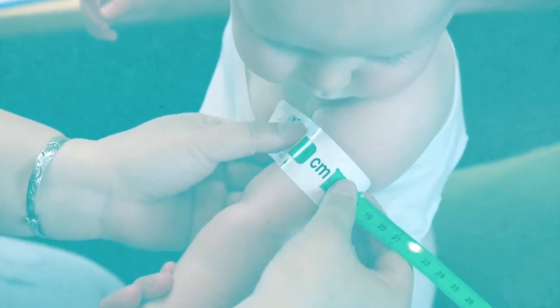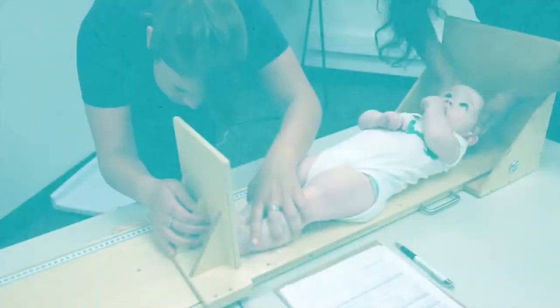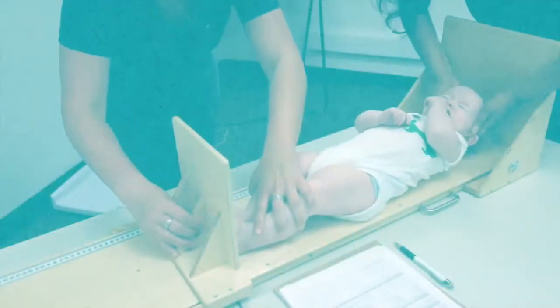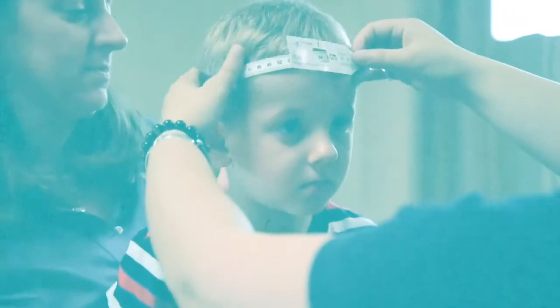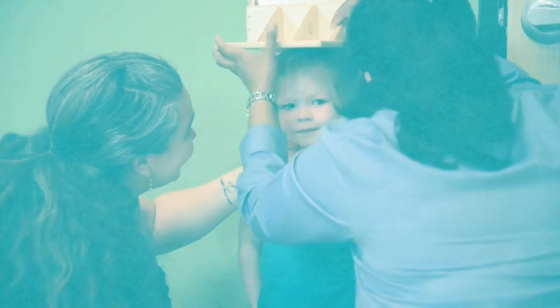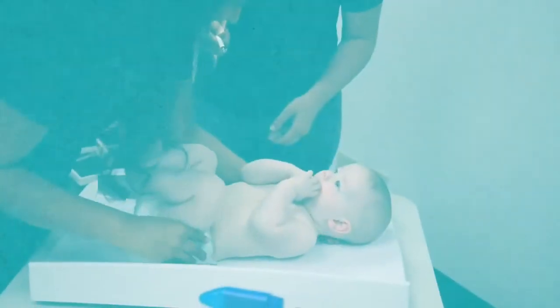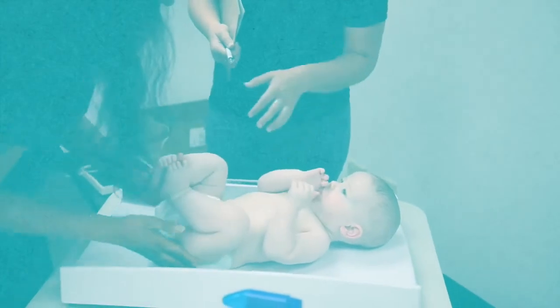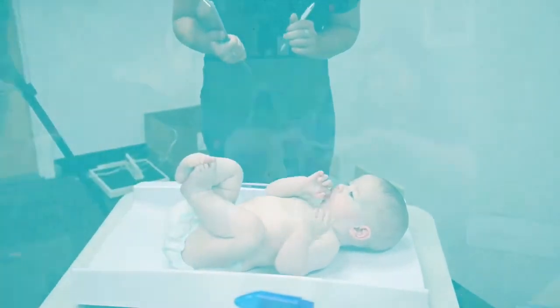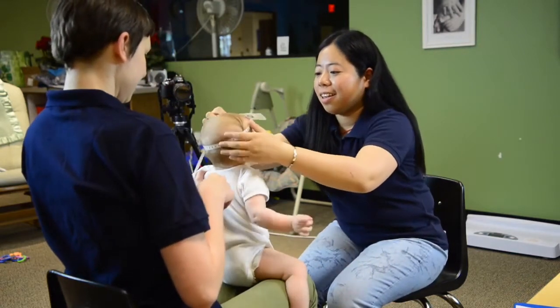Holt International's Child Nutrition Program is designed to standardize child growth screening protocols to ensure that children are growing to their full potential. An important part of this process is anthropometric measurements, which refers to the way that children are measured and includes measurements like height and weight. This video will demonstrate proper procedures for measuring head circumference of a child.